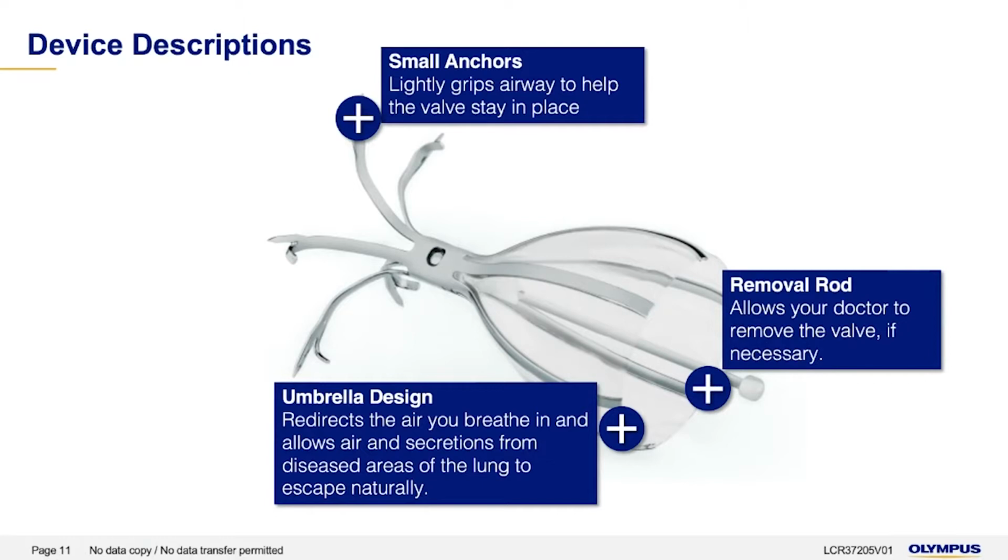And there's some theories as to why that may be, but I think equally important, if these aren't helping you in the slightest, we don't want to leave them in you. So we can simply go back in, grab them, and remove them. It's pretty rare in medicine that you get to hit the undo button when it comes to a procedure.